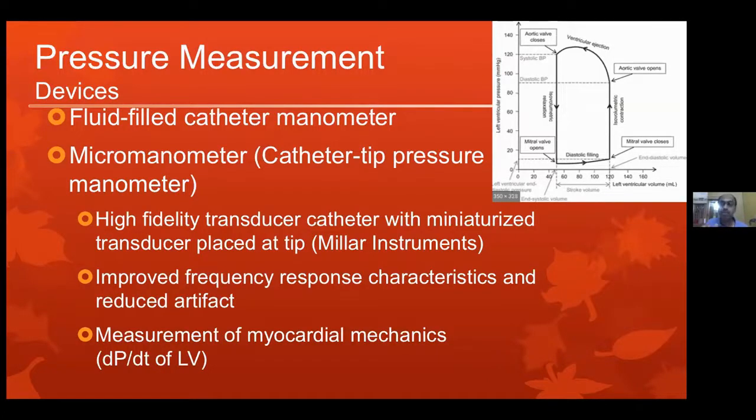and they are good enough in picking up all the hemodynamic disturbances that will happen at the 10th harmonic of a reasonable tachycardia. Let's assume a tachycardia at a rate of 120, which has a 10th harmonic of 20 Hertz, will easily be picked up by a transducer with a natural frequency response of around 60 comfortably.